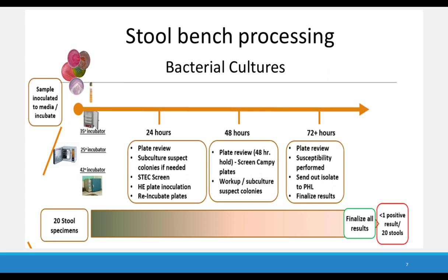This is just looking at what we all know is the standard manual bench processing for the bacterial cultures that we receive for stools. We have a variety of incubators that we have to incubate into after we set up the specimen. We have plate reviews. We have to subculture many colonies. We might have other tests to perform, such as EIA tests as well. And a lot of times, this is not a 24 to 48-hour process.